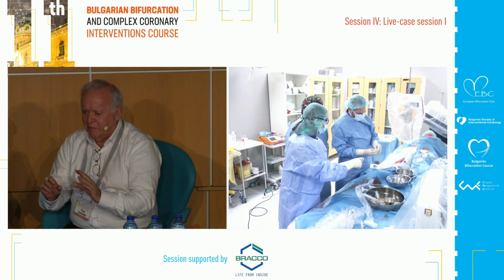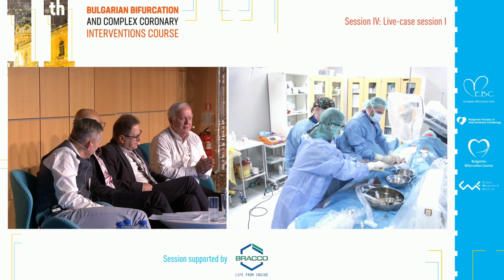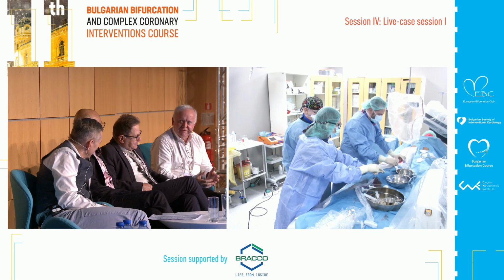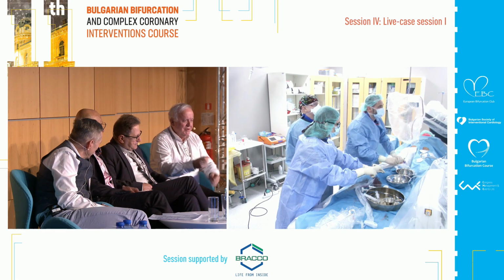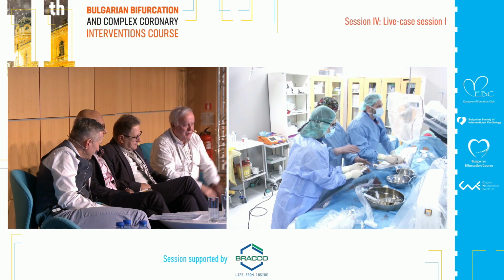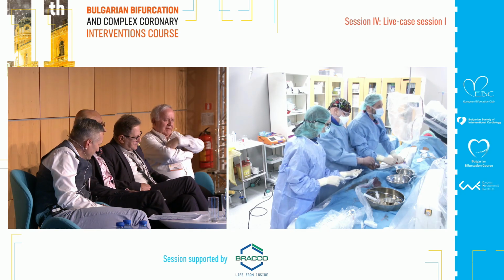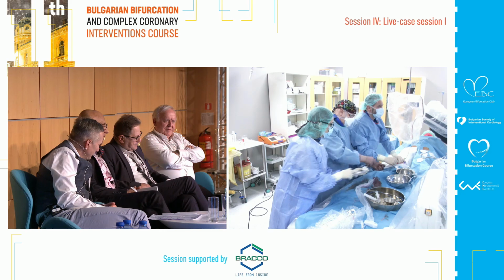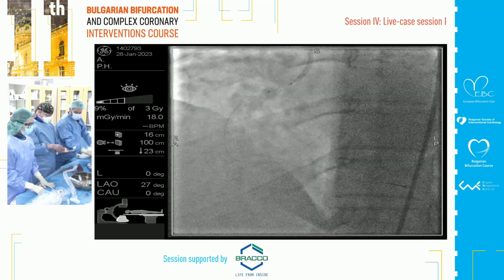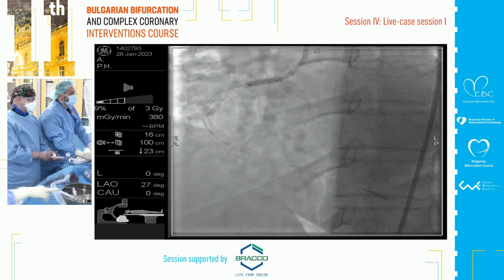A stent can be opened by 5 to 6 atmospheres, any stent. Yeah, sure. The problem of a non-compliant balloon having to go to high pressure is that it treats the wall, not the stent. Yeah, I agree. So here it is soft. You use the balloon you use to deploy the stent, and you go up if you want to have a half millimeter more. Yeah, I agree. But sometimes with the right coronary, you can use what is called ostial flash to get optimal deployment of the stent at the very ostium, because sometimes the ostium is like a funnel.